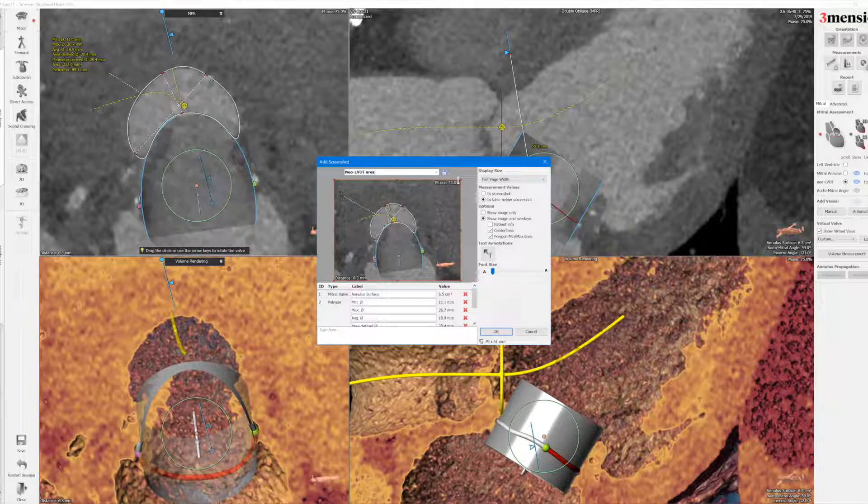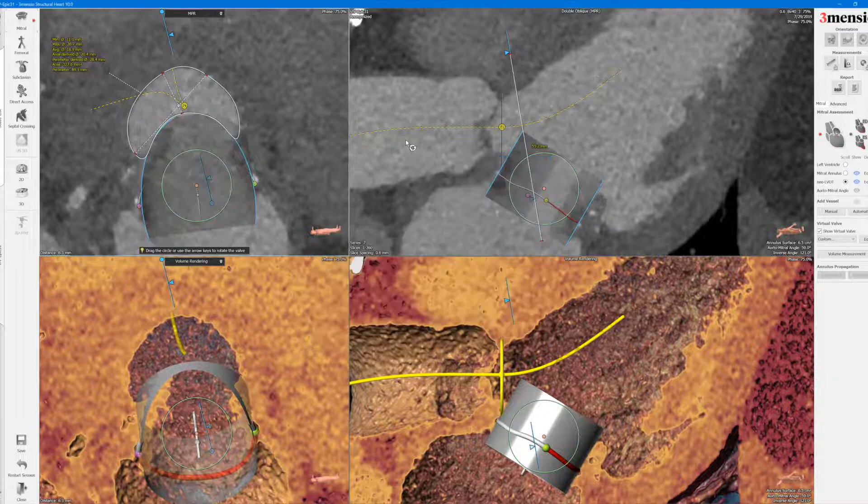You notice that this is more a diastolic phase, but in systole it should not be an issue either. The principle is the same — you want to do it at end systole to start, and then if the new LVOT is borderline or small, you can go into early and mid systole to compare and to see whether there's any risk of LVOT obstruction.